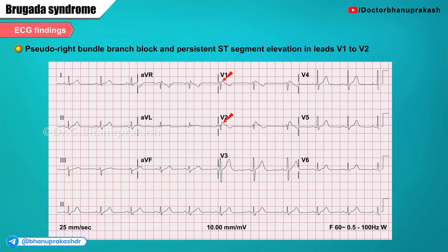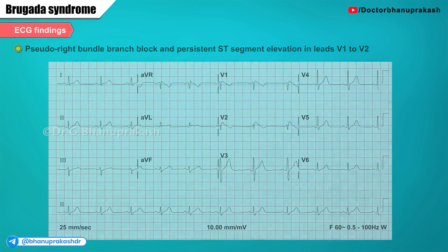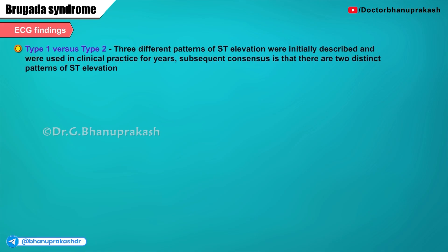Here's the 12-lead electrocardiogram of the Brugada pattern. In this ECG, you can note the presence of a pseudo-right bundle branch block and persistent ST segment elevation in the leads V1 and V2.